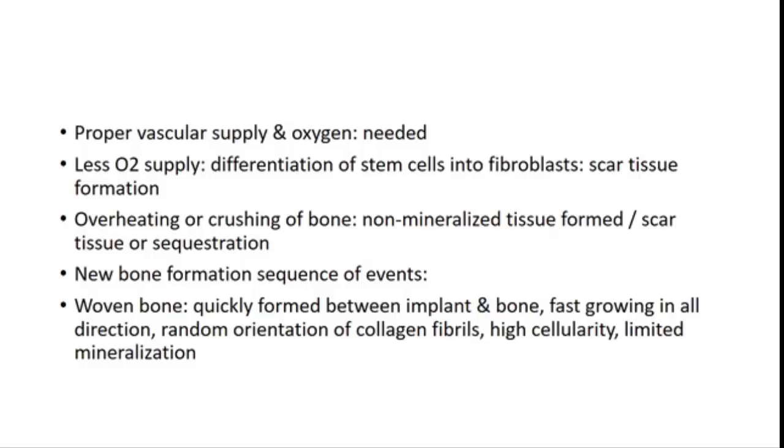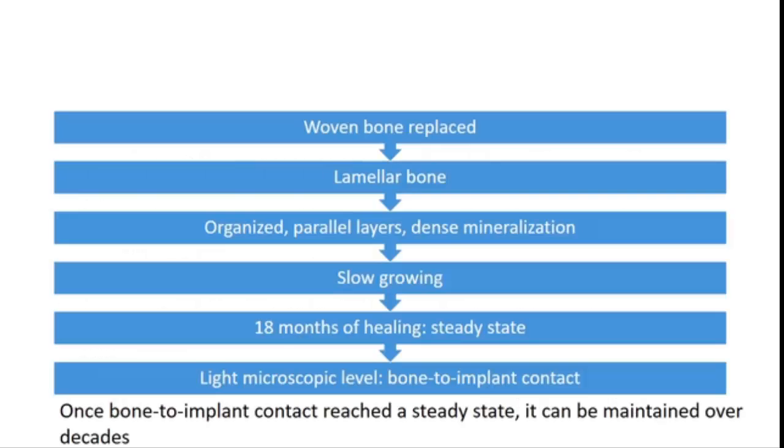I must have repeated these terms many times. It is nothing but the site which you create with the implant drills, where the implant will be placed in the bone. That's called the osteotomy site. Going to the next slide.